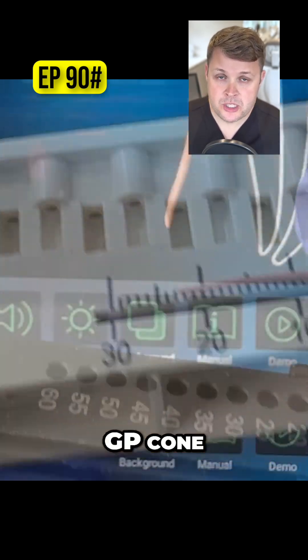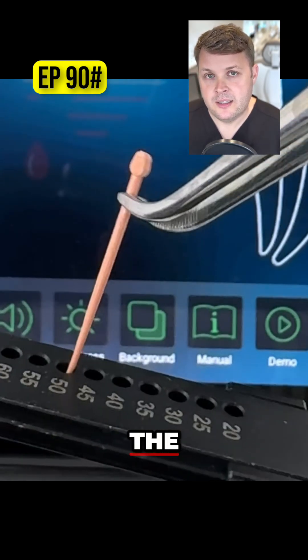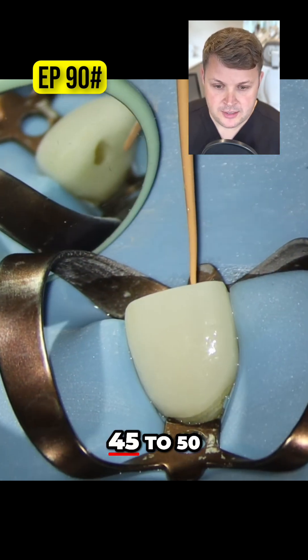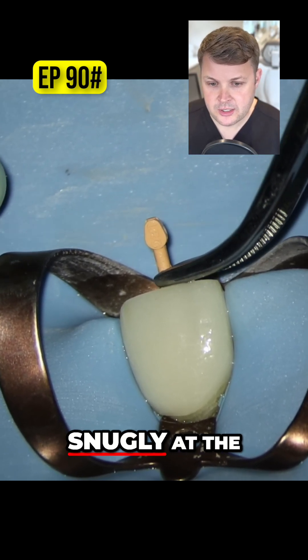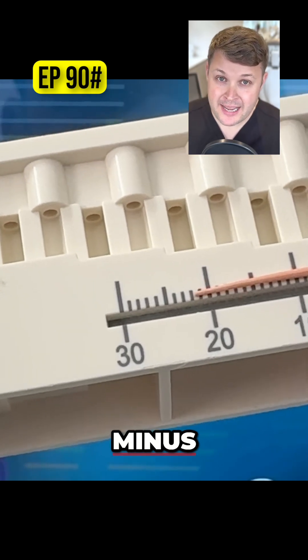So we don't need to go up another GP cone. Essentially, what we do is we just snip off the GP cone at 50. We use a specialized GP cutter here, so we've gone from 45 to 50. And as we push this GP cone to length, it fits nice and snugly at the working length, which is 21.5 millimeters.